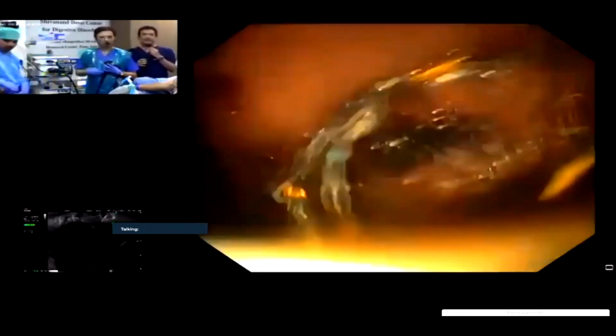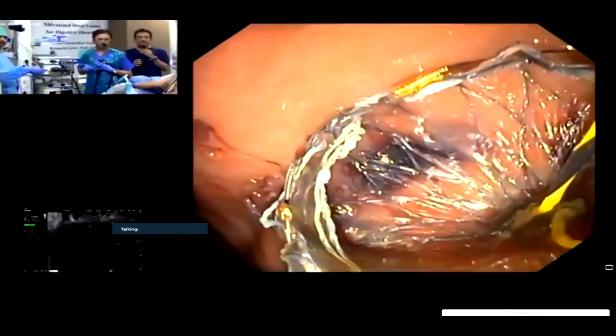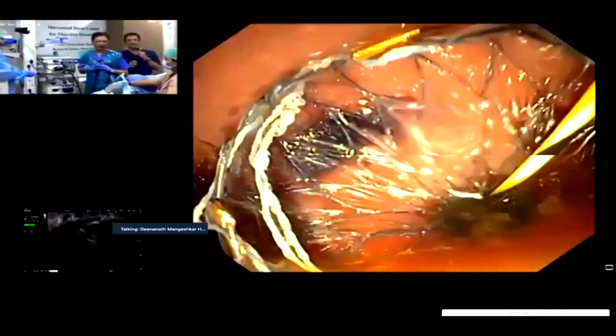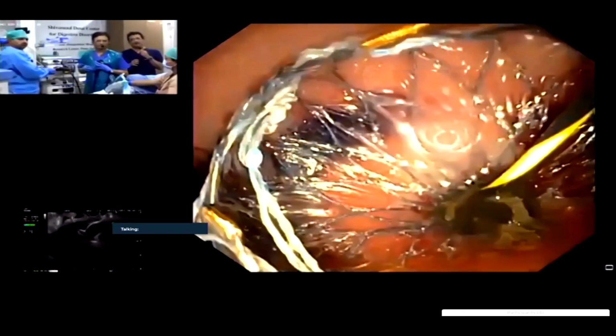This patient will probably undergo an MRCP later also, and we'll again evaluate whether there is a disconnected duct. He also has some changes of chronic pancreatitis. So he will probably need ERCP, and he needs an MRCP. So all that will need to be done.